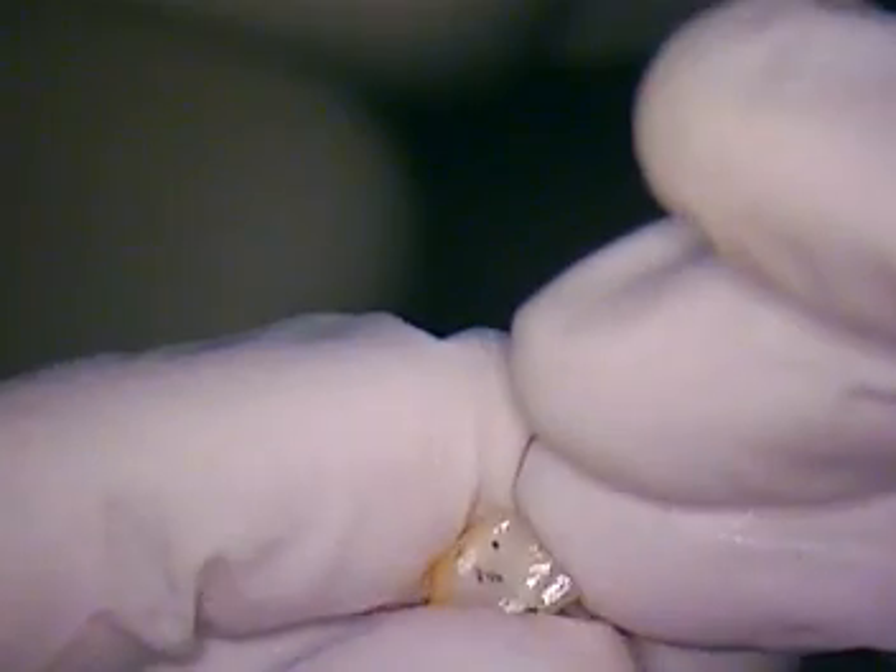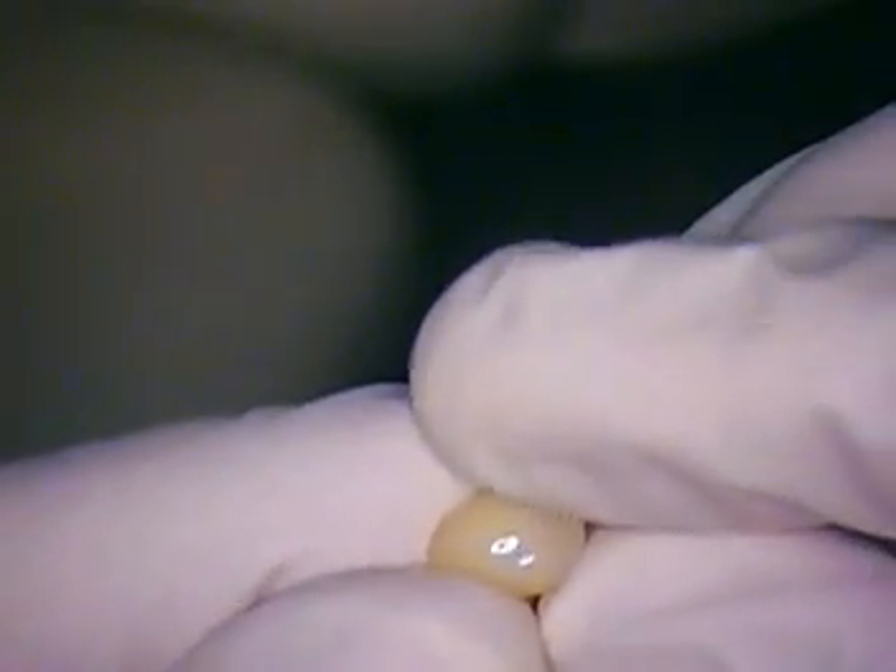Absolutely, we need silane. But that's a nice Emax crown that's going to go in on top of the zirconia, so you've got porcelain on porcelain. And that really is the best aesthetic way to go. So I'm glad we get that little bit of pressure there — that'll be good.